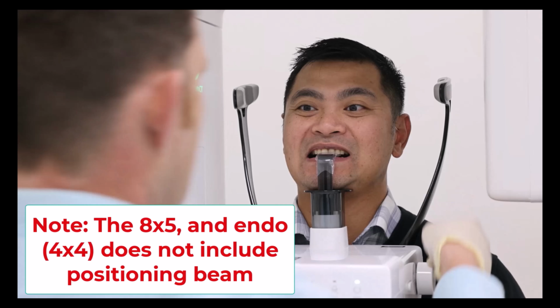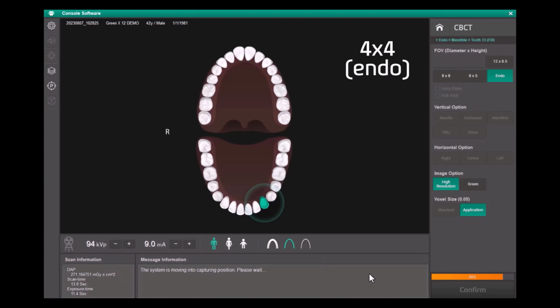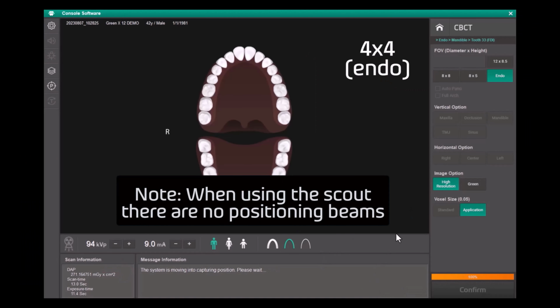Please note, when taking your scout image, there are no positioning beams that display on the patient's face. Ensure that the patient is biting in the bite grooves, chin seated firmly on the chin rest, and ensure a flat occlusion. Have the patient smile and adjust if necessary. Click OK and hold down the exposure button to take your image.